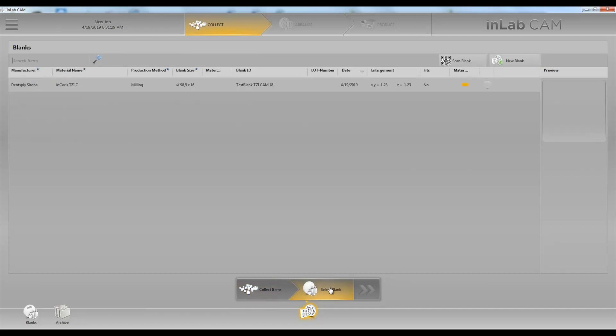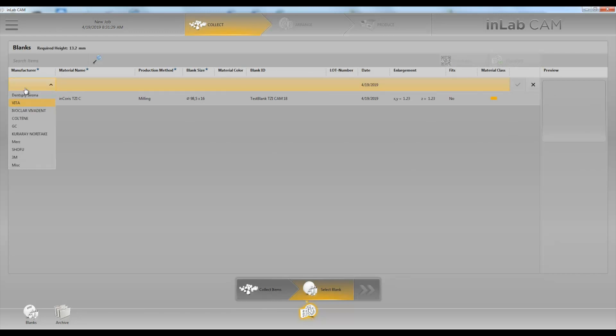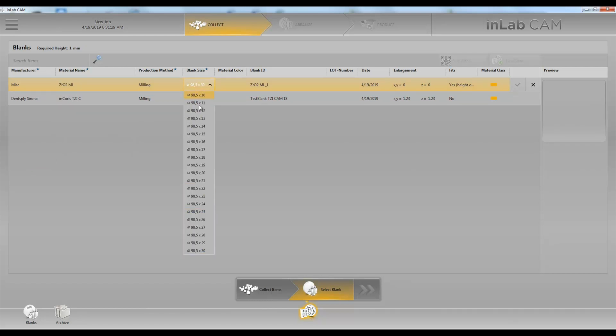Next we'll select our blank. It's not in the software in version 18.1, so what we're going to do is choose New Blank and choose Miscellaneous and Zirconia Multi-Layer. In this case we'll choose 18 millimeters.